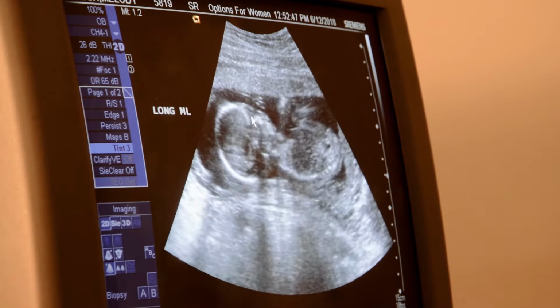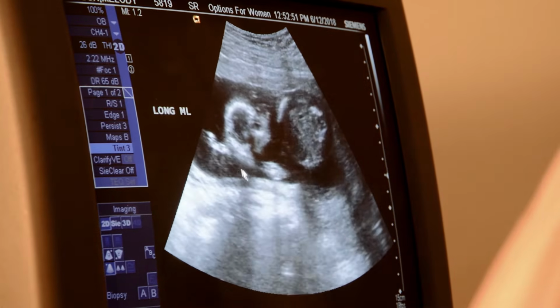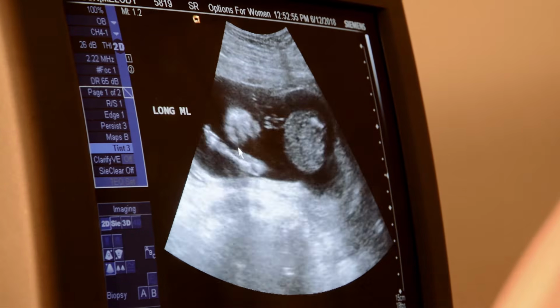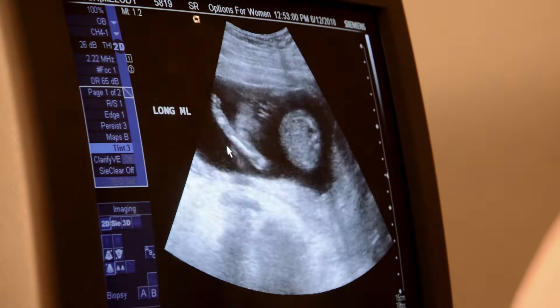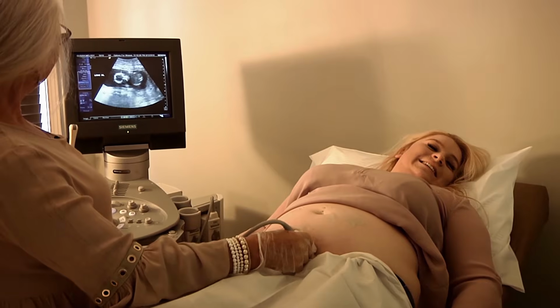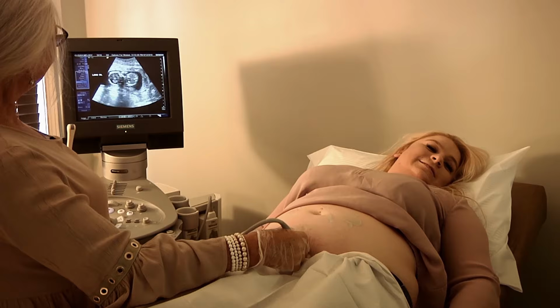Here's the face, the eyes. His hand over here. There's his hand, waving at you. Hi, Mom. Hi, Auntie. The eyes. And here's the heart beating.